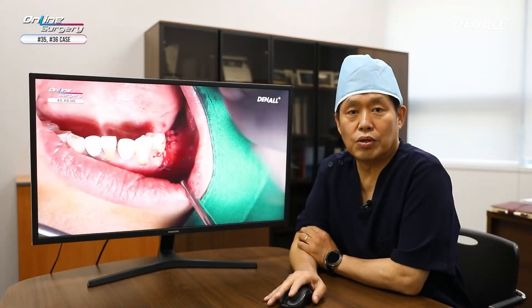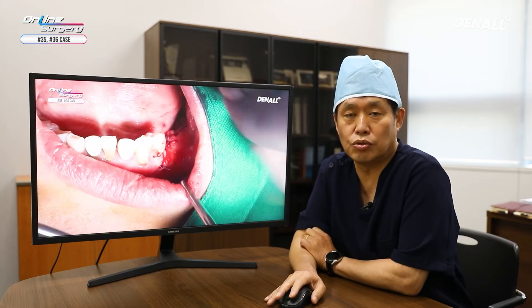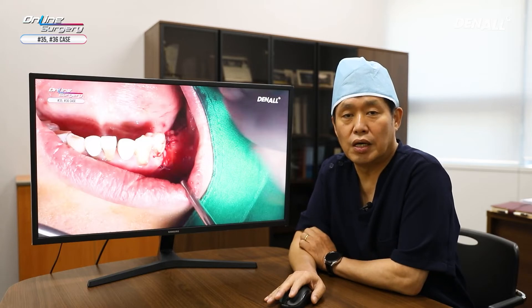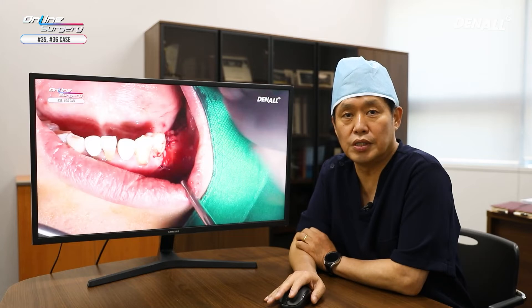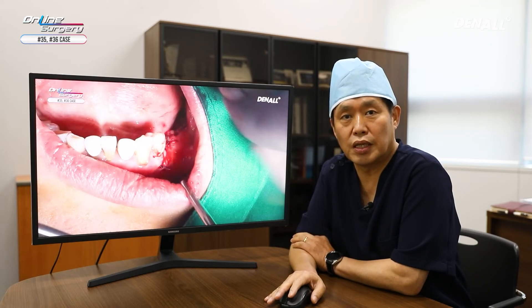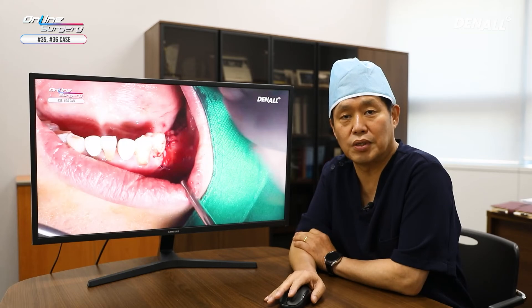In this case, I wanted to emphasize that even if you use one guide, you don't just blindly do flapless surgery. If GBR is necessary, make an incision, place the implant using one guide, connect the cover screw, and on top you can use bovine bone for a simple GBR. Two layers of collagen membrane were used and suture was done.